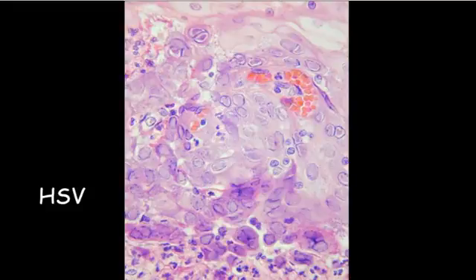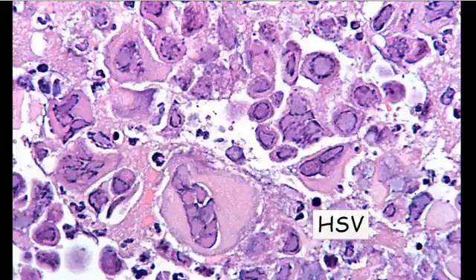But this really shows you that you do get both A and B inclusions, because these kind of look more like CMV inclusions with that halo, but you will see this in herpes and adenovirus as well. And of course the big juicy multinucleated cells.